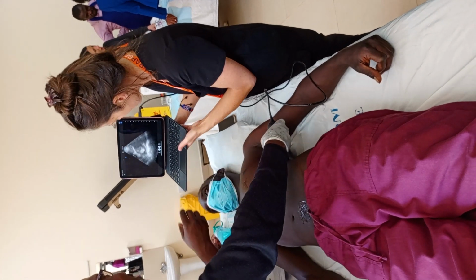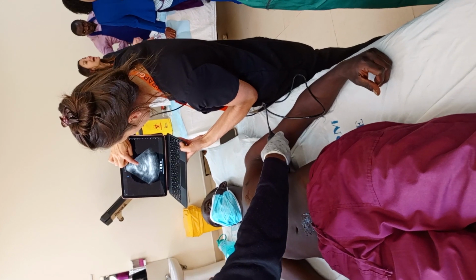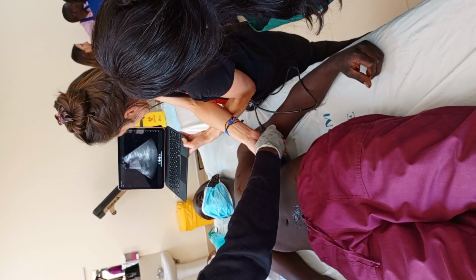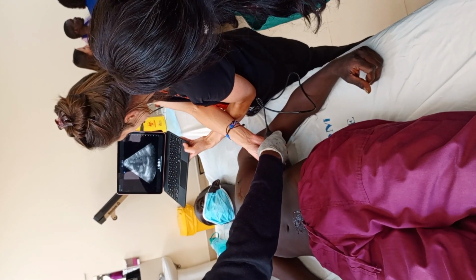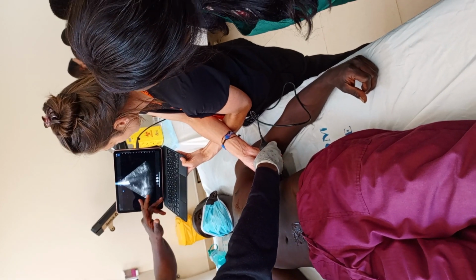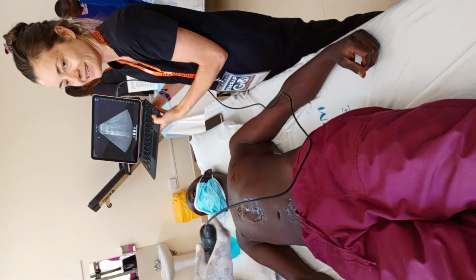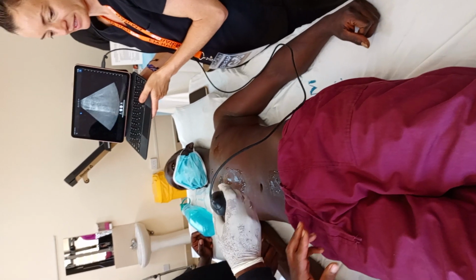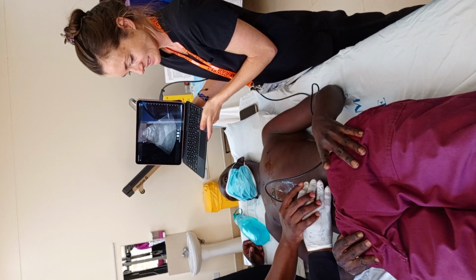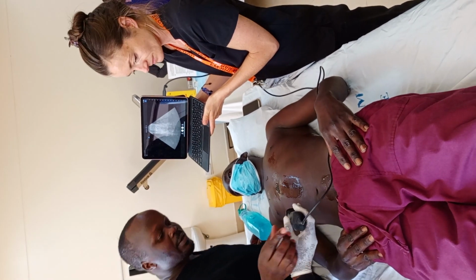Or the 18 gauge ones in practice. Those work just as well. They're just a little bit less, they're not designed for the really. You want to go down a little bit more? 90% of the time. There. That's a very good view. Good. Okay. And then one more time on that bladder. If you're doing this, it's almost like there's more active force. Use your body to get it in.